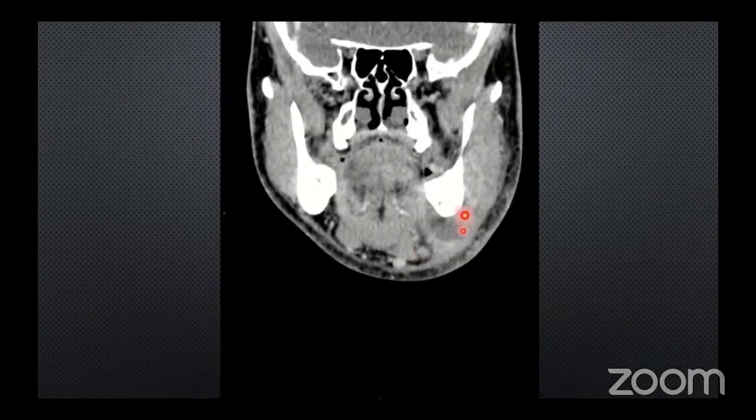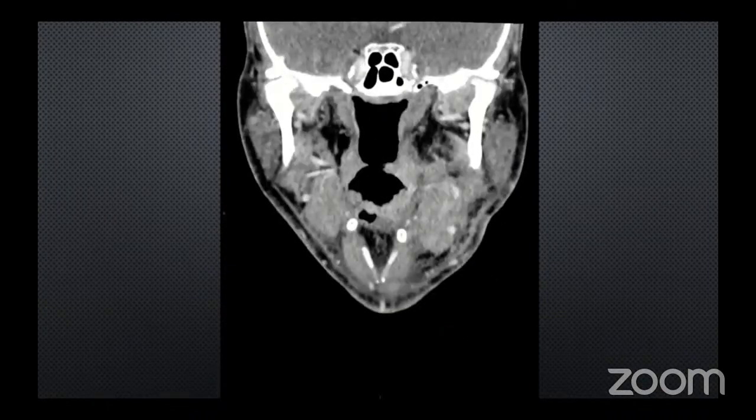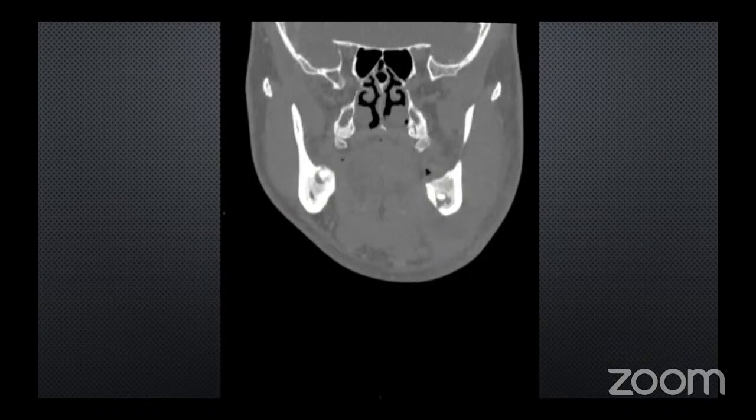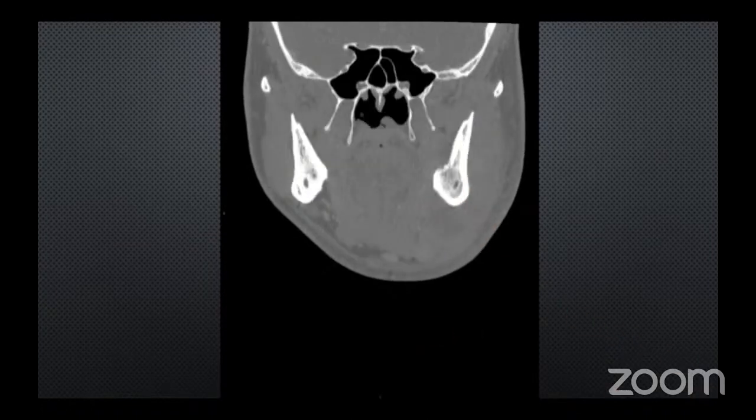And you can see here on the coronal imaging, and these are your bone windows here, displaying very nicely the cortical breach.